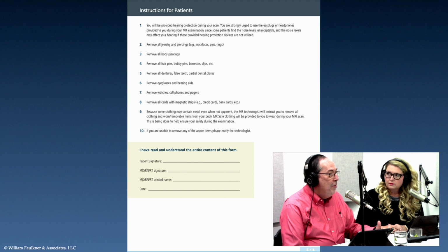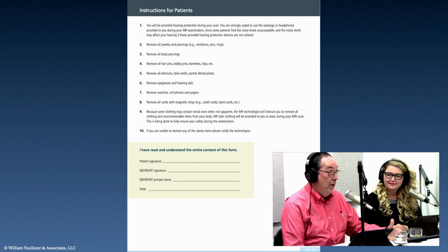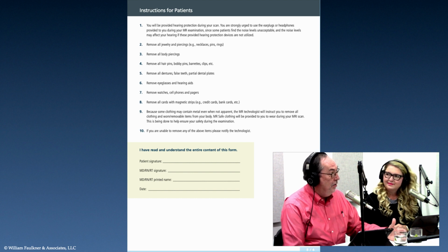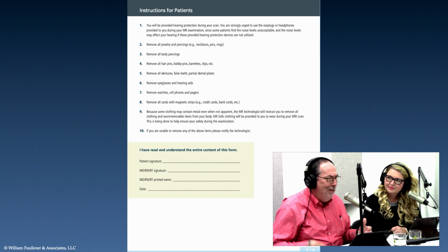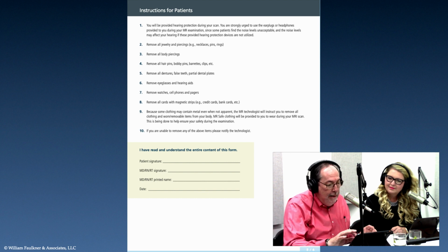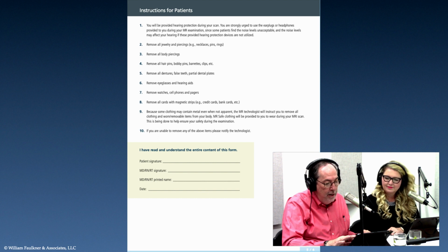You want to get yourself in trouble in a lawsuit? Don't follow the instructions for use that the vendor provided you. Why did you choose not to follow their instructions? So again, I don't get the hearing thing. But they do say that for any research sequence not FDA approved, you must provide hearing protection. Okay, what about the others? I don't get it.